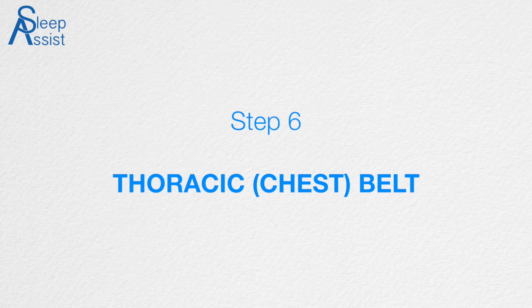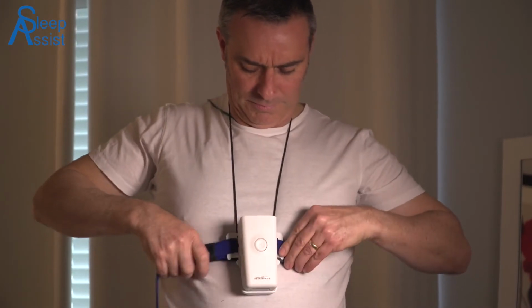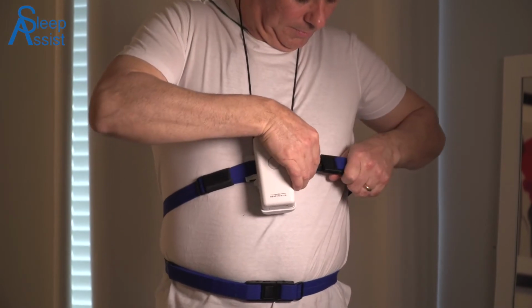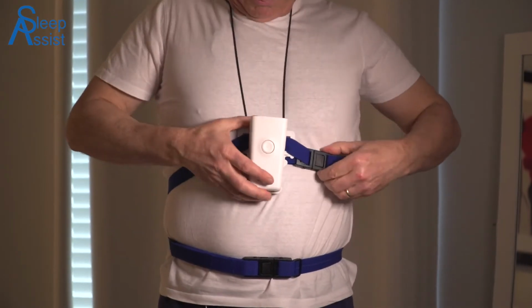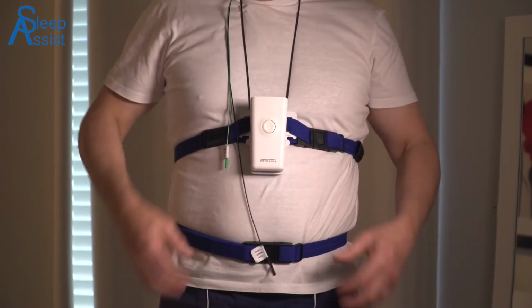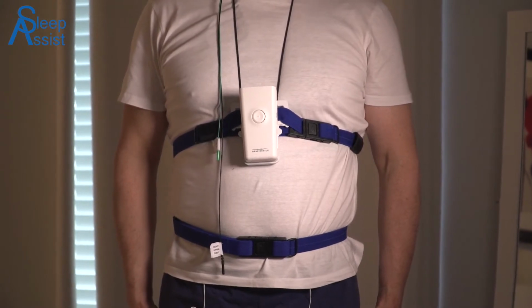Step 6. Thoracic chest belt. Place the recording device lanyard around your neck. The belt will have already been personally fitted to you, so no further adjustment should be required. Wrap the thoracic belt around your chest. The recording device will now be sitting above your stomach. Ensure that the two sliding Velcro patches are facing forward.